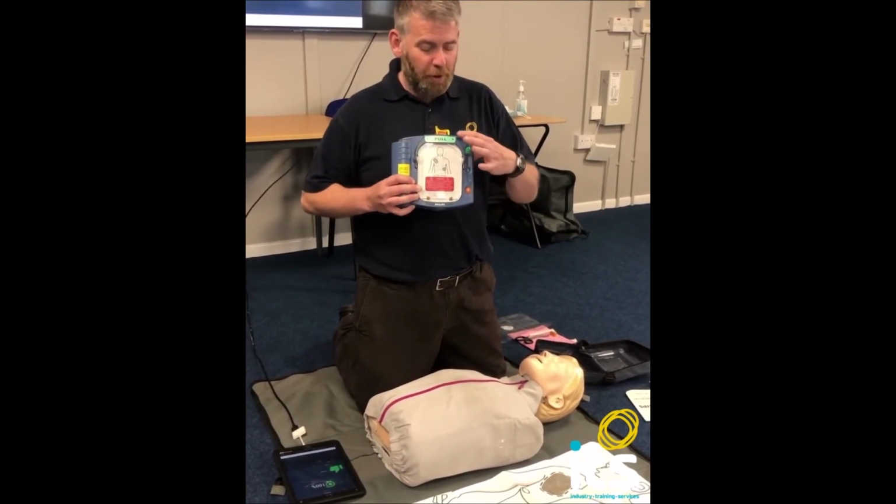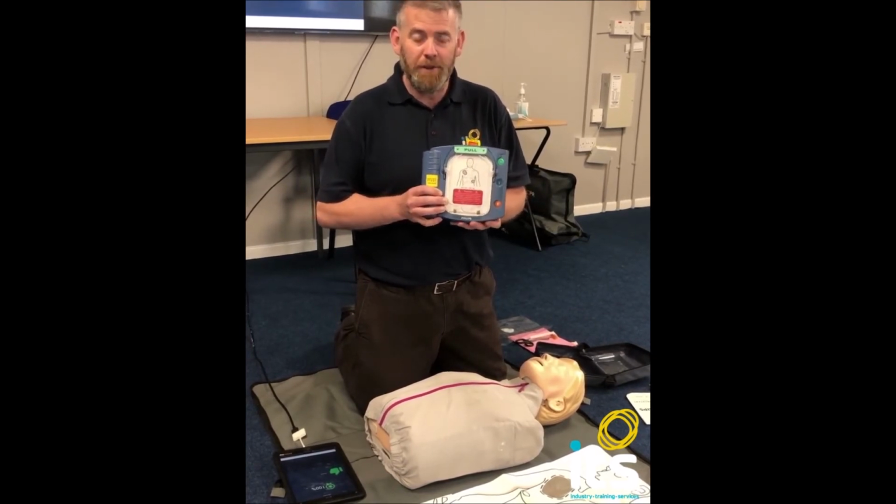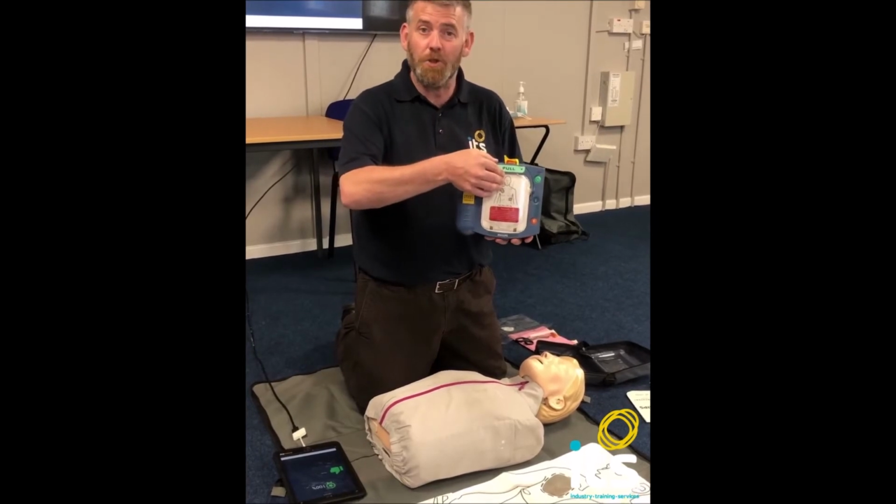Some will have an on switch or a pull lever. It makes no difference really at the end of the day, folks. They're all doing the same thing, irrespective of shape, size, model or colour, and listen to it.